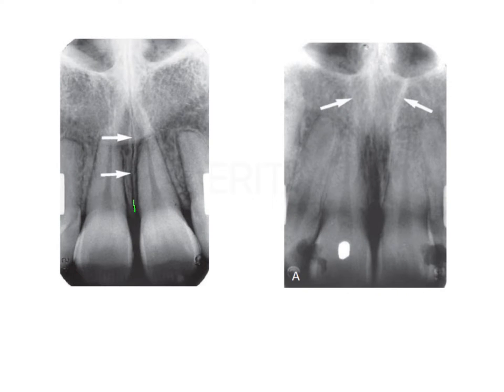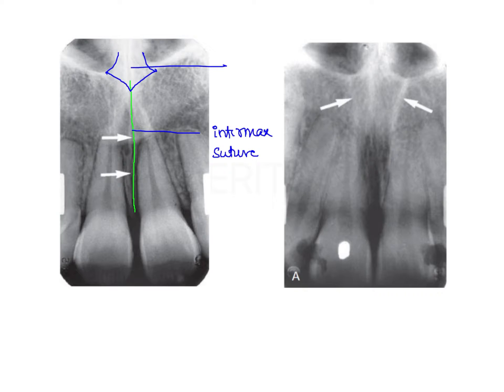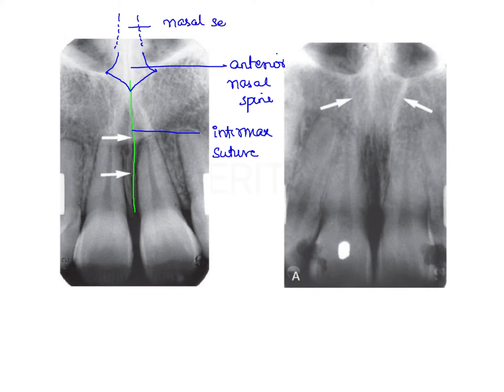In the first radiograph, we can find a thin radiolucent line between the two central incisors, which is the intermaxillary suture. The intermaxillary suture extends from the alveolar crest between the central incisors superiorly up to a V-shaped radio-opaque structure known as the anterior nasal spine. The anterior nasal spine is followed superiorly by the nasal septum, and on either side of it is the floor of the nasal fossa, also called the floor of the nasal aperture.